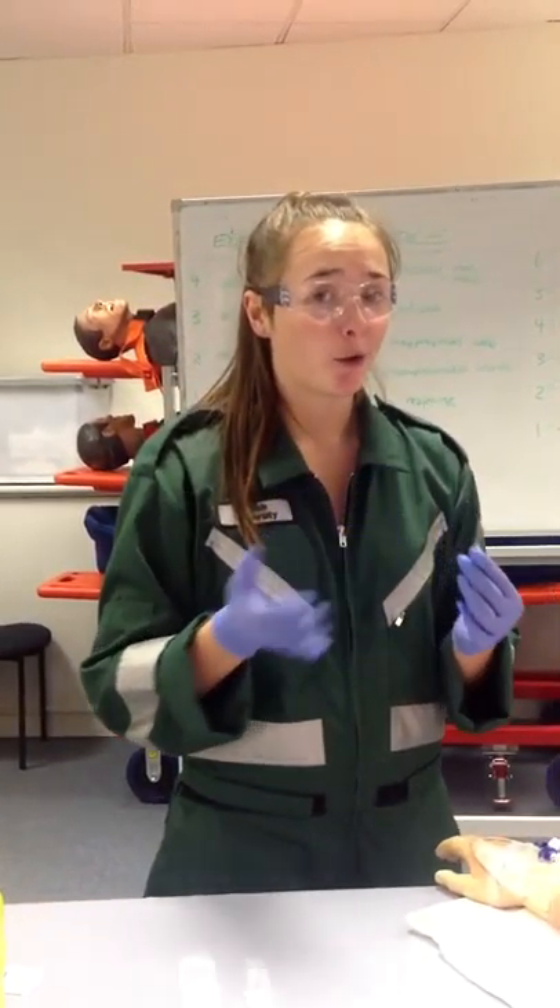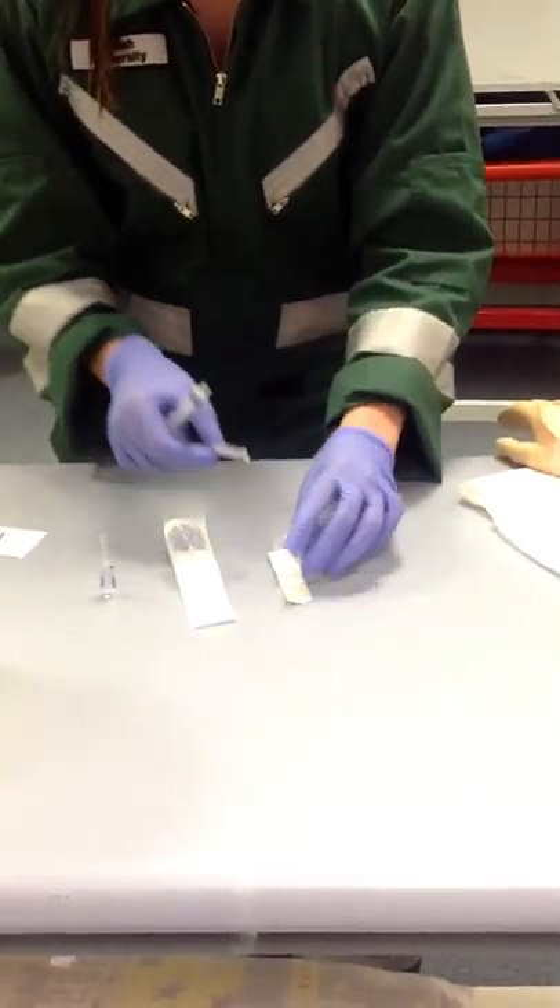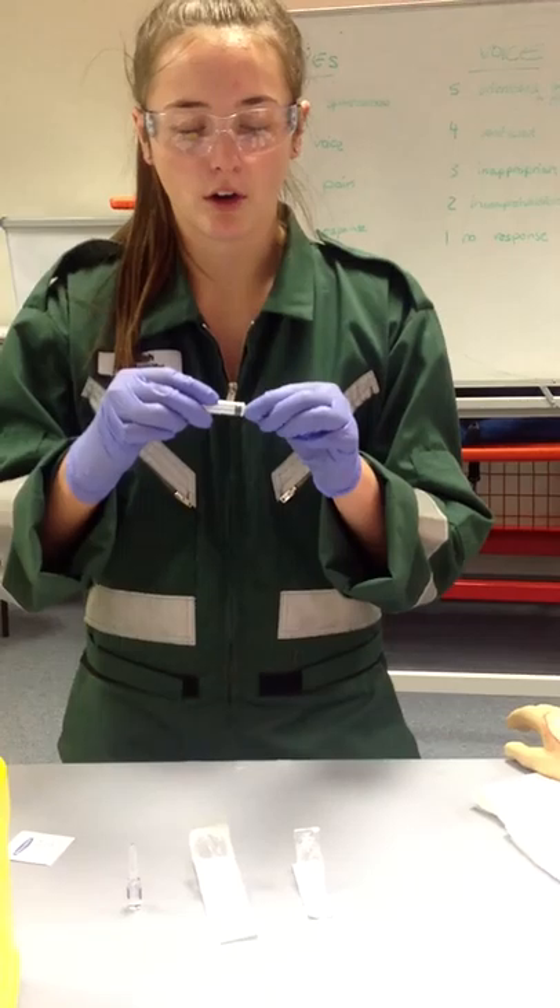I've checked with my patient — they have no allergic reactions to anything and they're not in hypovolemic shock. So I've got my adrenaline there. I'm then going to pull out my syringe and attach it to my needle, like so.